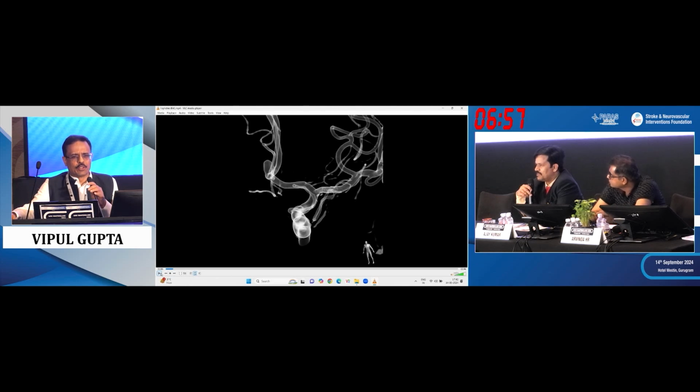No micro will take 3 shapes and remain fine. So you have to use a new micro in these kinds of situations. One may try, but at least 2 micros one would need. Once you have shaped them in a perpendicular shape, it will never take a perfect reverse shape. All right? So be open to using a new micro in the procedure when you're reshaping and re-entering.